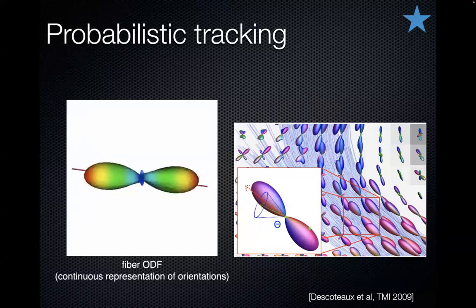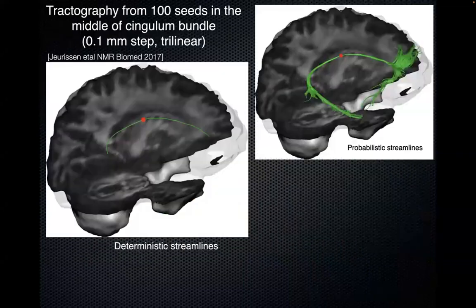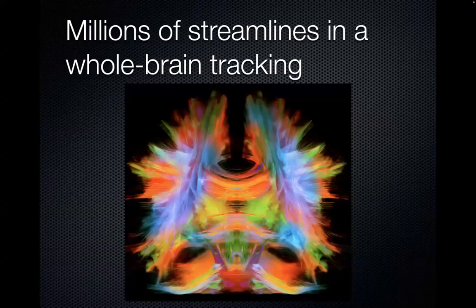So this allows you to traverse white matter better. Most software now have probabilistic tractography as a default: FSL, MRTrix, DIPY, us, and TractoFlow. And you can see these are papers that are getting old in a sense, and there's a consensus here in the community. So let me just fast track this.